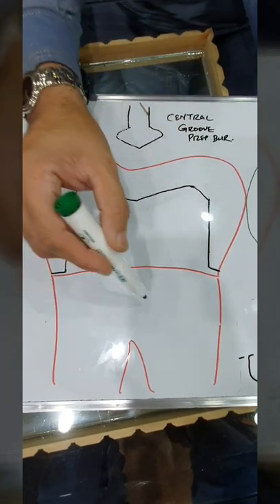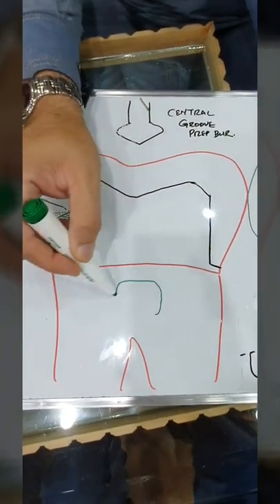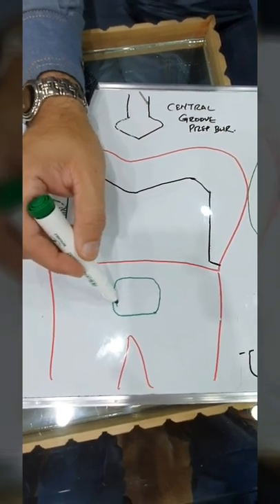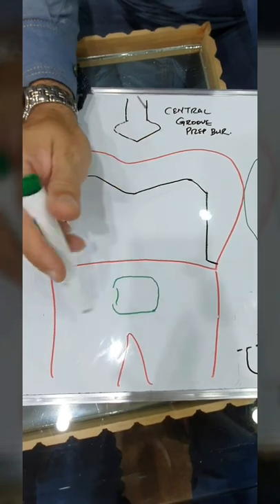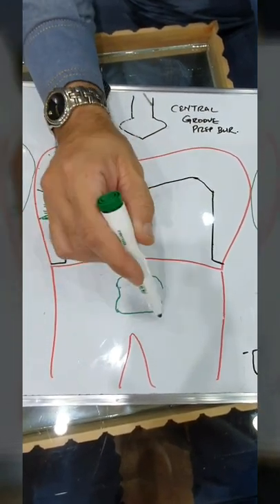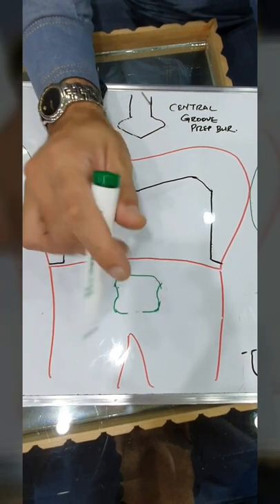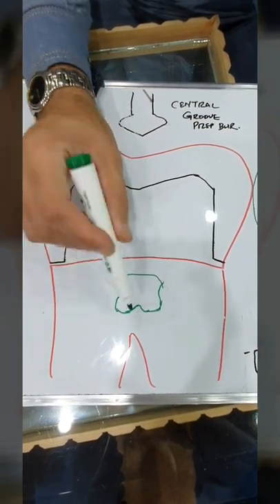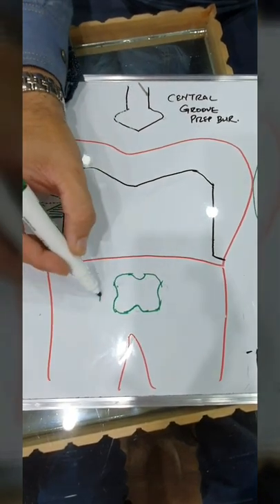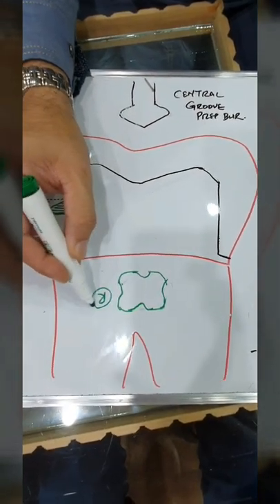When you have the features in a crown prep, if this is a crown and you're looking at it from the occlusion, if you do the crown prep and you have the mesial dip in the margin, because that's how the root normally is, if you have the mesial dip, you have the distal dip, and if you have interradicular dips on the lingual and interradicular dip on the facial, then you have resistance to rotation.